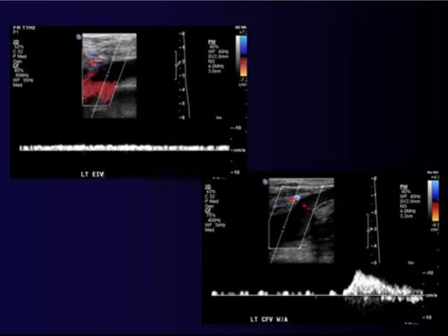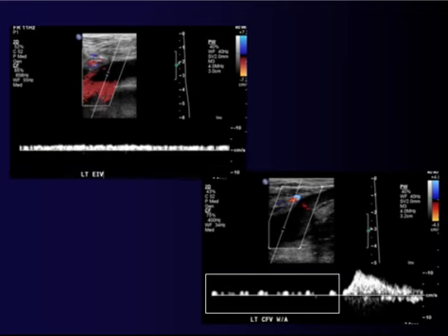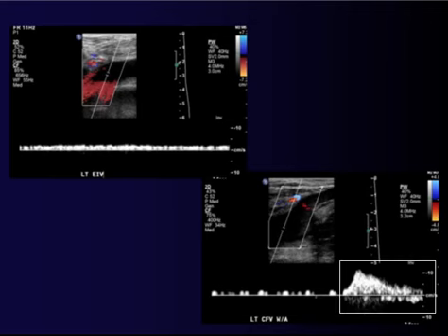And in this same patient, you can see that there is no flow detected on color, but there is very slow flow detected on the spectral Doppler. Here we have it again. And this is the same pattern demonstrated all the way down the extremity. But when we augment, there is suggestion that there is no obstruction.